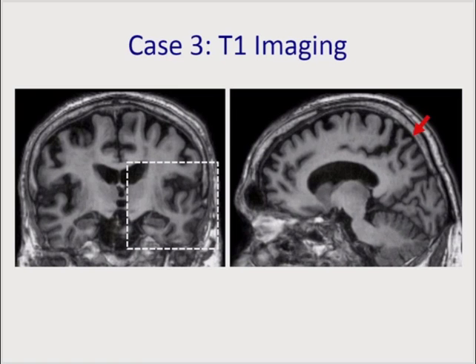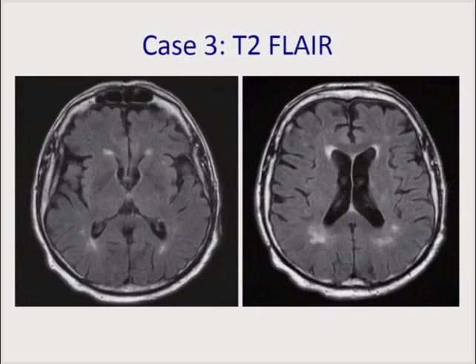Looking at the sagittal sections, again, there is some parietal atrophy, not a lot of frontal atrophy, but some posterior midline, posterior cingulate, and precuneus atrophy. So again, sort of consistent with this idea of an Alzheimer's picture. He did have some cardiovascular risk factors, so the question is, how is vascular disease contributing here? So this is what his image looked like.